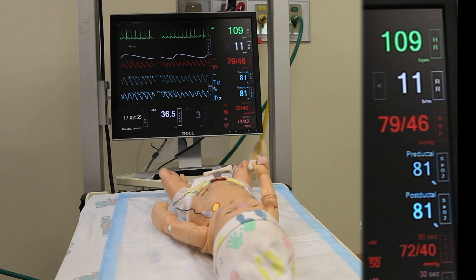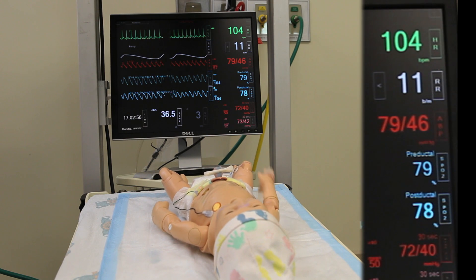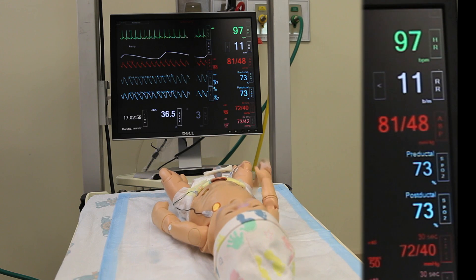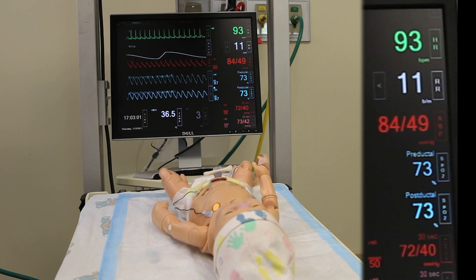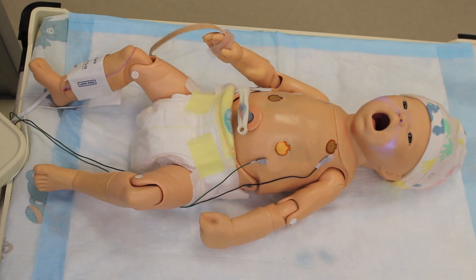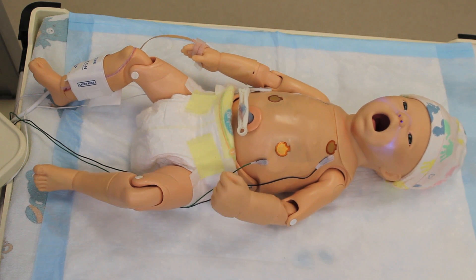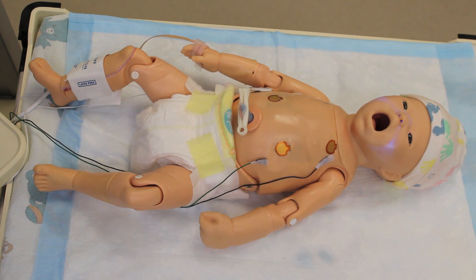In addition, if you tried to bag mask ventilate the baby, you would not be able to move air. When the baby is finished having the seizure, if you're bagging him, you'll see that there is chest rise, and then the baby will show some physiologic correlation of improvement.